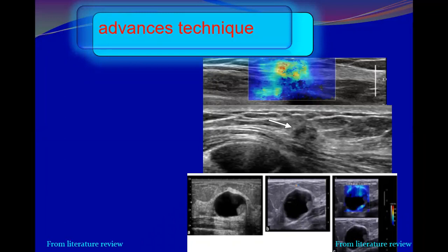Is it soft? No, I said it is hard, meaning not red. Yeah, but you have a mix of yellow and red.